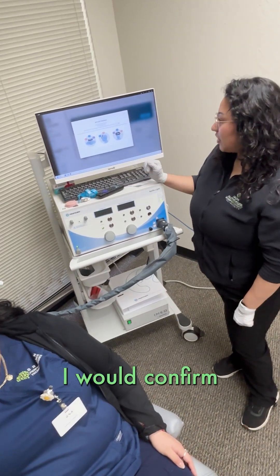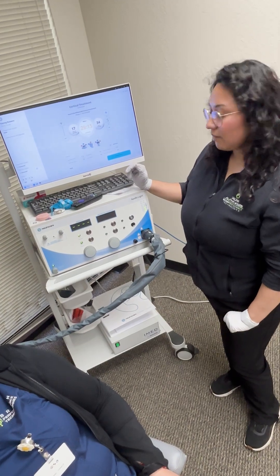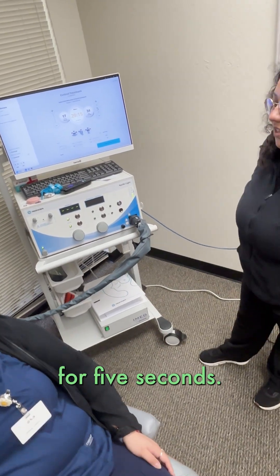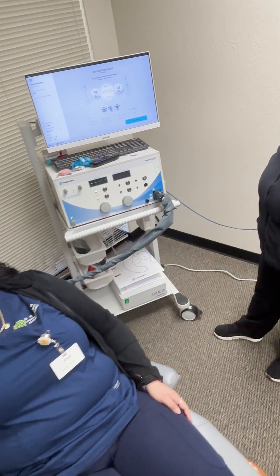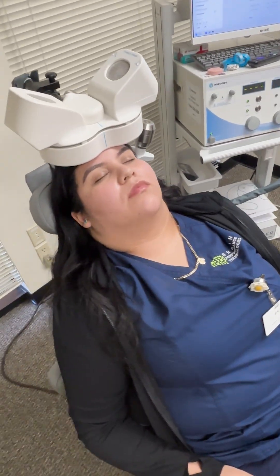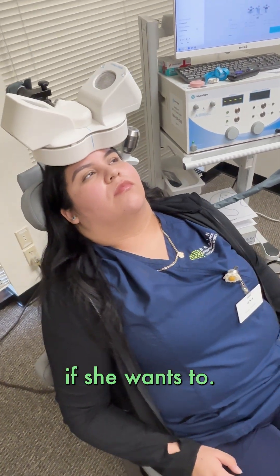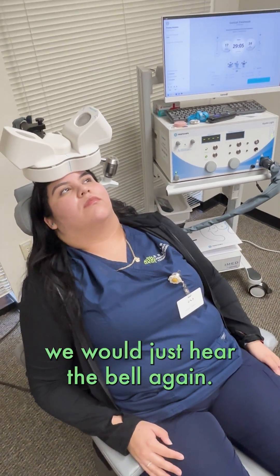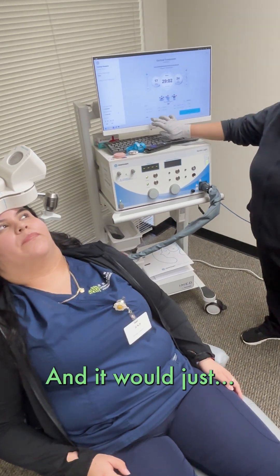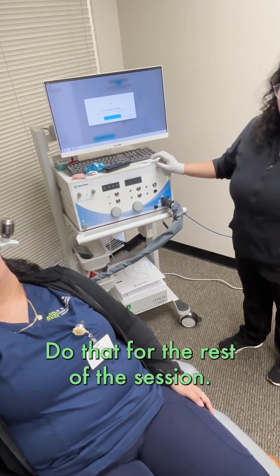I would confirm and then it would start. You hear the bell, then I would ask her to close her eyes for five seconds. Now she gets a break, so she gets to open her eyes if she wants to. Then we would just hear the bell again, and it would just do that for the rest of the session.